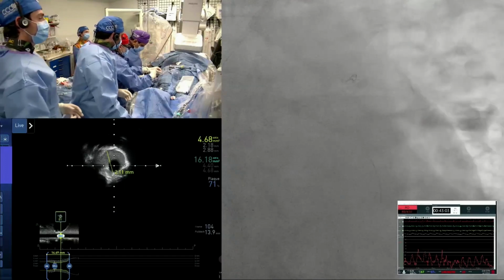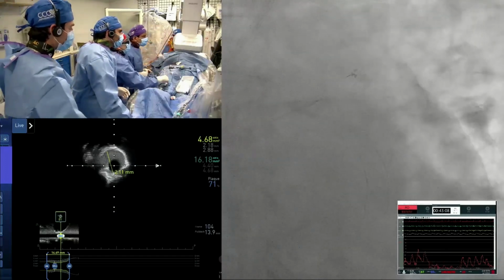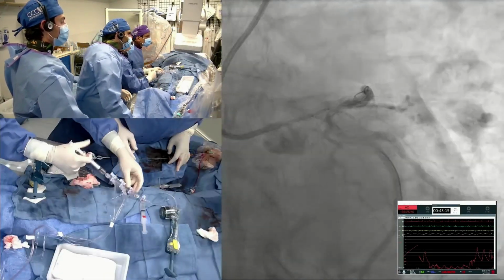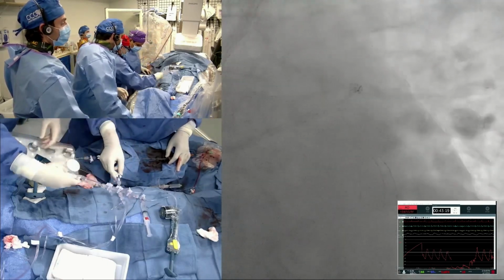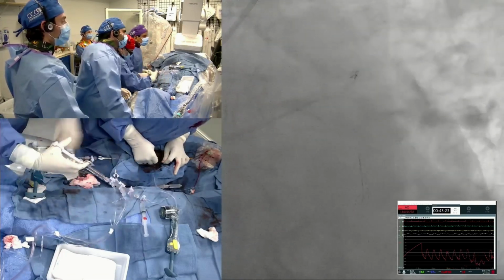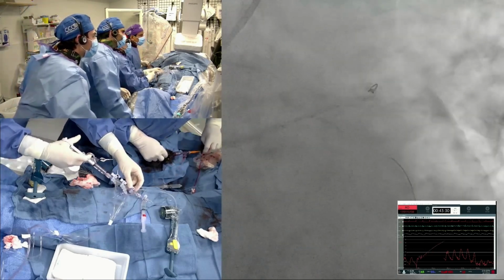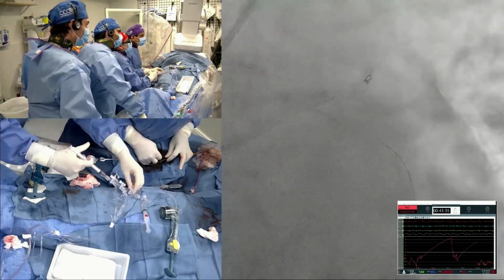All right, Dr. LaSala, quick comment. Yeah, I just think it's important to remember, if you look at the histology when IVL is done, it's not just the radial fractures, the 3 around the circle, it's longitudinal as well. And every modality that has more resolution shows that there's more fractures. If you go from IVUS to OCT, to micro CT scans, to histology, almost each one of those modalities goes up another 20 to 50% in terms of the degree of fractures. You don't see the whole degree of fracture, in other words.